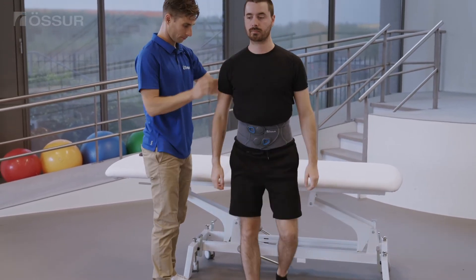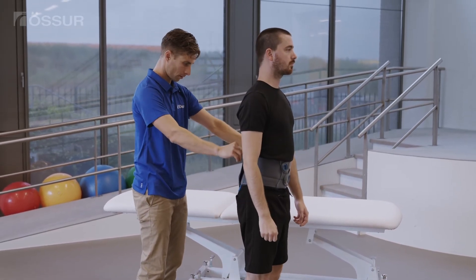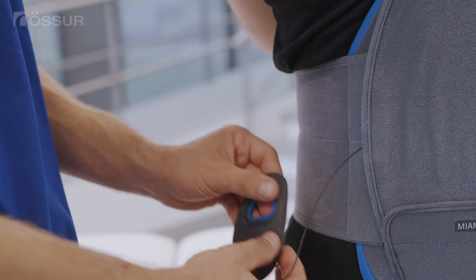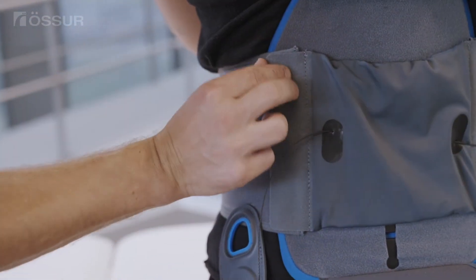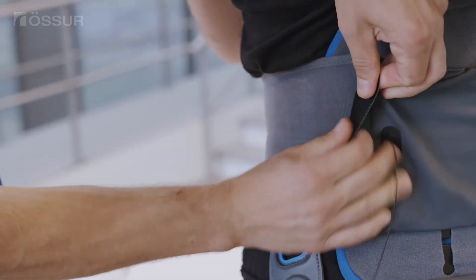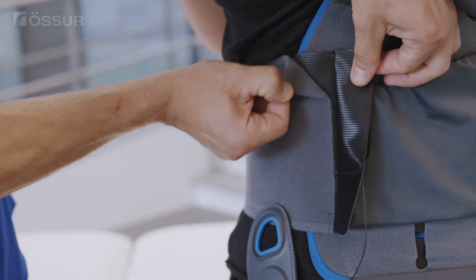The brace may require fine tuning for comfort, fit, and stabilization when sitting, standing, or ambulating. The Miami LSO compression system also allows adjustments by detaching the belt arms from the hook and loop strip posteriorly. Trimming the belts at an angle can give the opportunity to accommodate different anatomies.